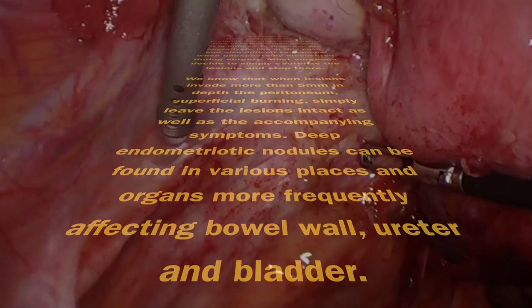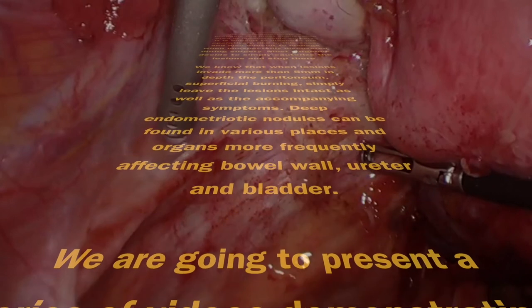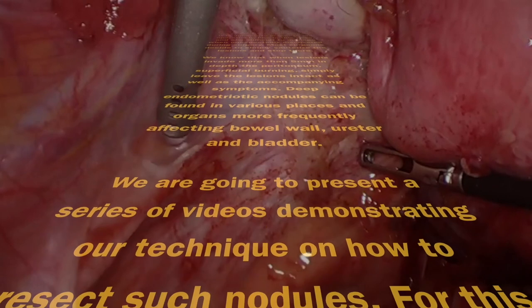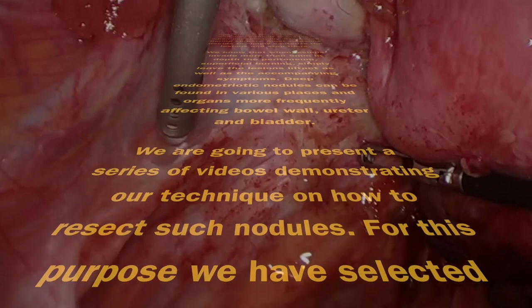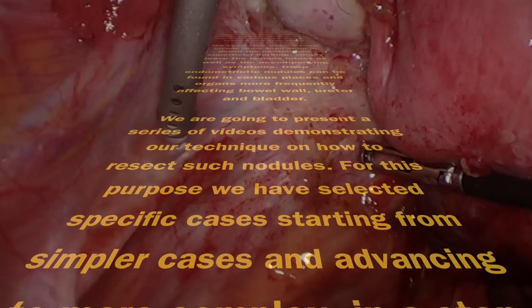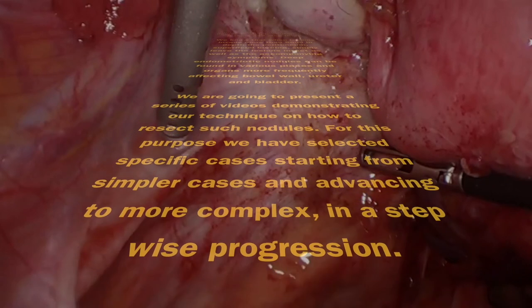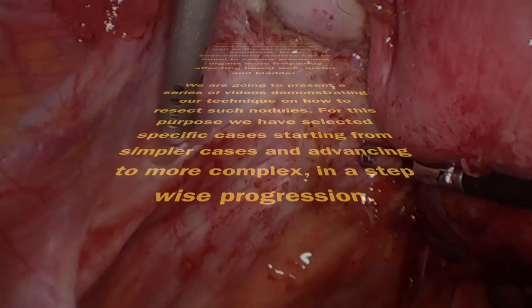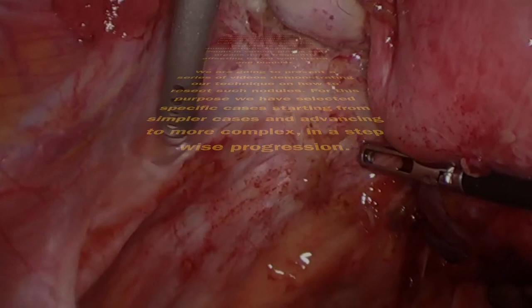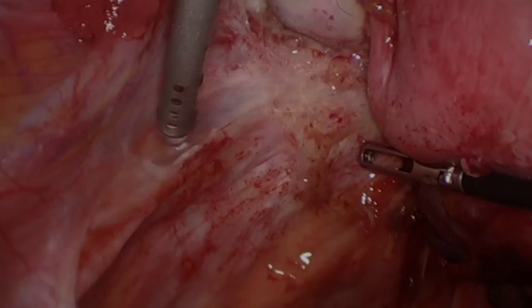Deep endometriotic nodules can be found in various places and organs, more frequently affecting the bowel wall, ureter, and bladder. We are going to present a series of videos demonstrating our technique on how to resect such nodules. For this purpose, we have selected specific cases starting from simpler cases and advancing to more complex in a step-wise progression.